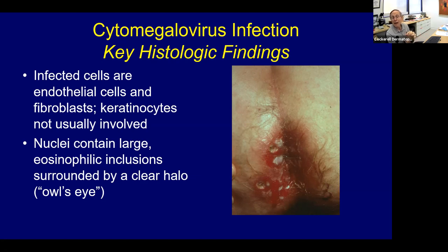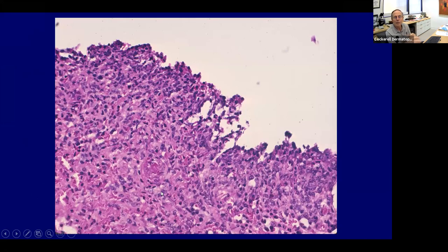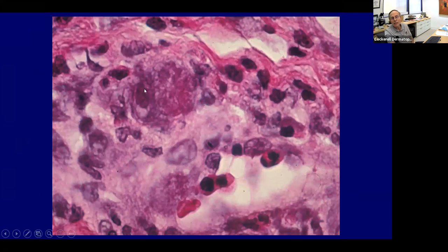Cytomegalovirus — this was actually on my board examination. Here you have an HIV-positive patient with peri-anal ulcers due to CMV. You get large eosinophilic inclusions with a clear halo, giving an owl's eye appearance. These include both cytoplasmic and nuclear inclusions. CMV tends to infect non-epithelial cells — fibroblasts and endothelial cells more commonly — so look inside blood vessels.